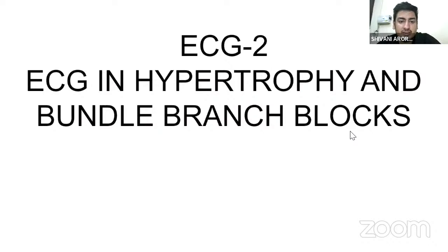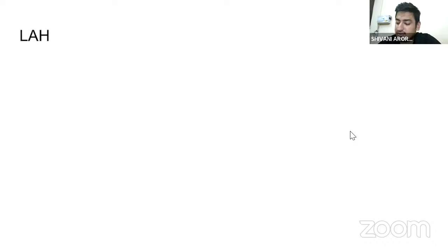Today we will be having a discussion on ECG in hypertrophy and bundle branch block. In the last discussion, we discussed how to interpret an ECG and what the basics of an ECG are. So let us start the discussion.